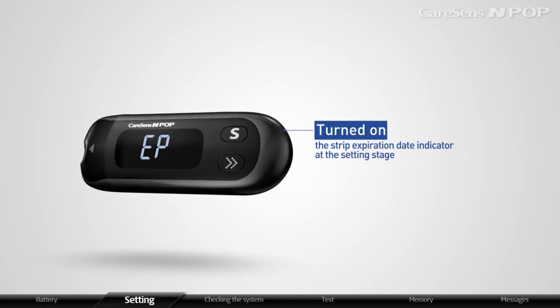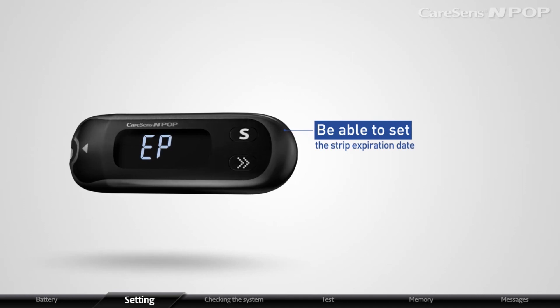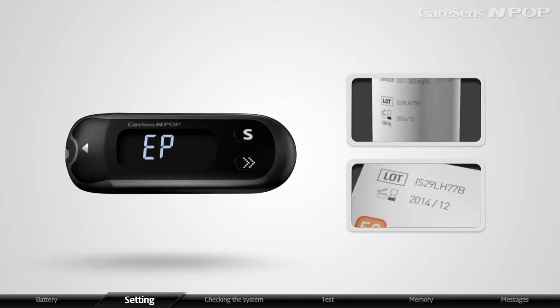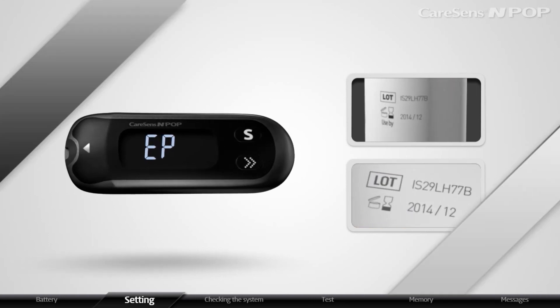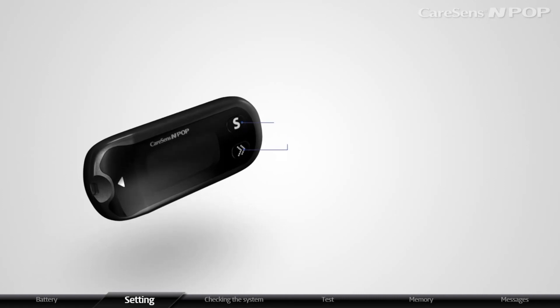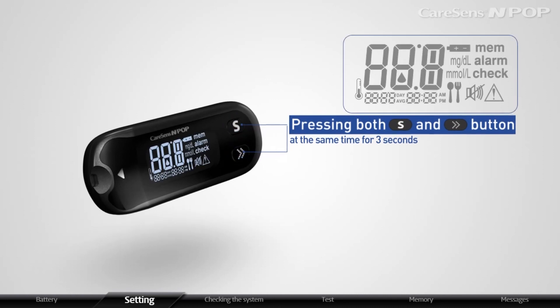If you have turned on the strip expiration date indicator at the setting stage, you will be able to set the strip expiration date. Strip expiration date is marked on the strip vial or box. The meter will display all features and then EP when pressing both the arrow and S button at the same time for 3 seconds.